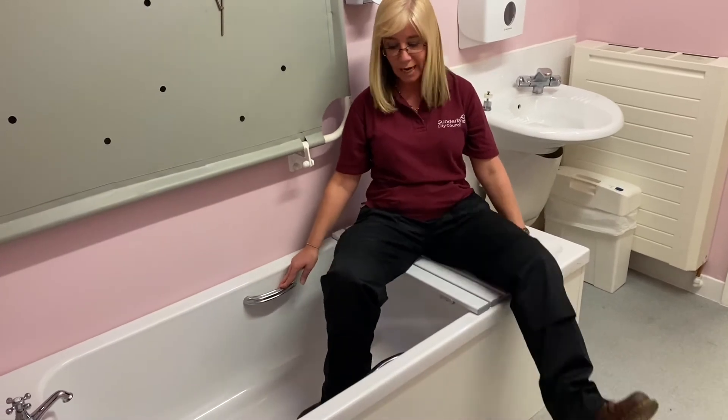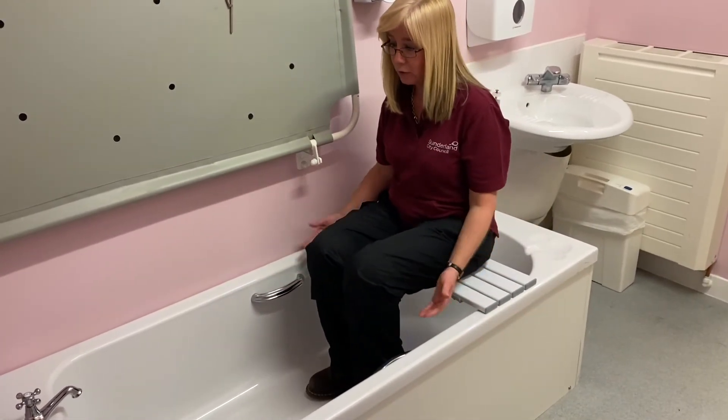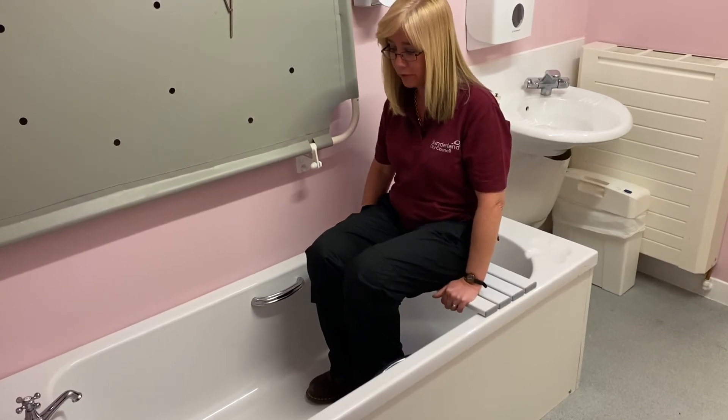Lifting one leg at a time over the side, you would sit in a seated position using your shower facilities.